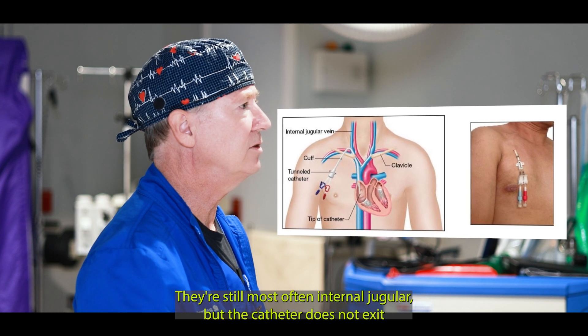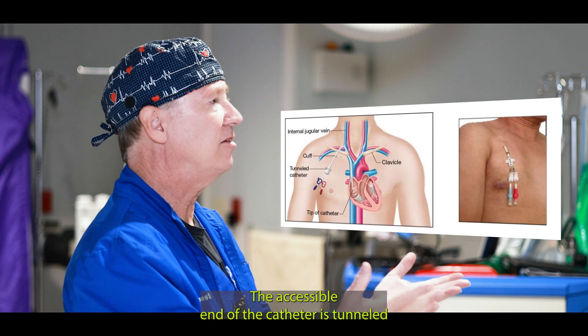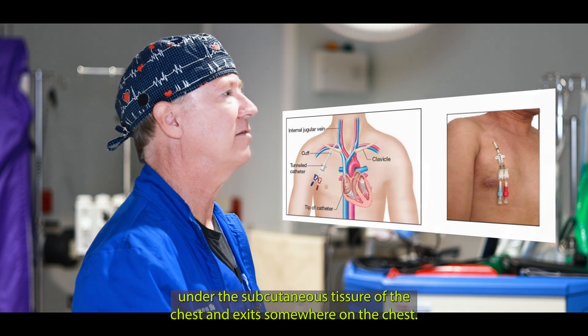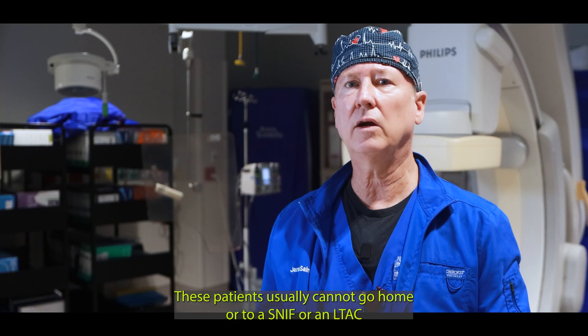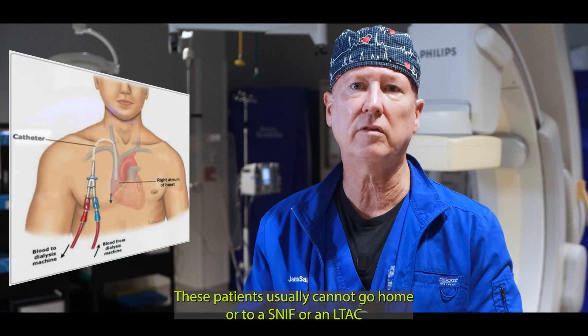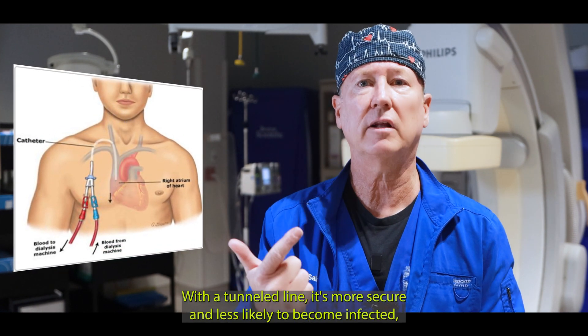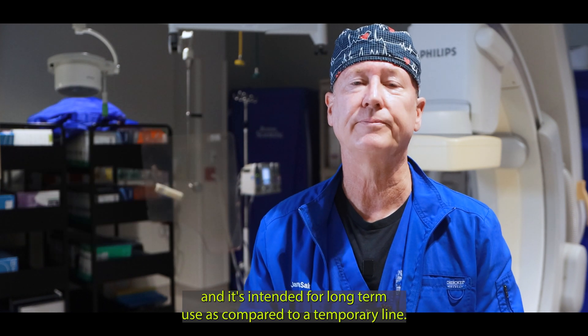Tunneled central lines and hemodialysis catheters are a different story. They're still most often internal jugular, but the catheter does not exit at the insertion site. The accessible end of the catheter is tunneled under the subcutaneous tissue of the chest and exits somewhere on the chest. Patients usually cannot go home or to a SNF or an LTAC with a temporary line, but they can with a tunnel line. It's more secure, less likely to become infected, and intended for long-term use compared to a temporary line.